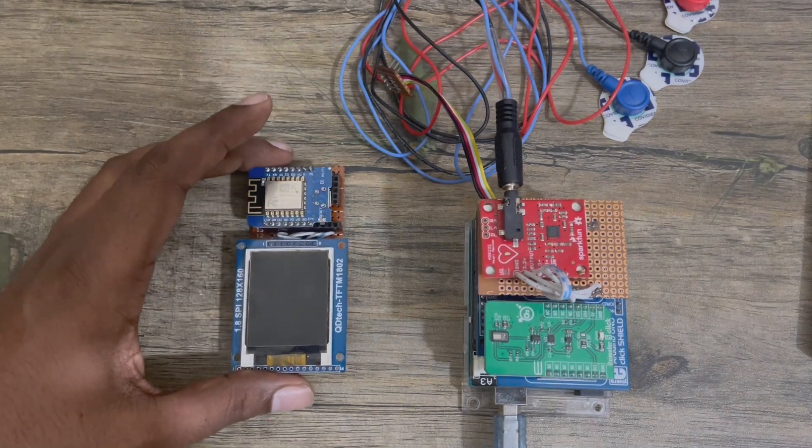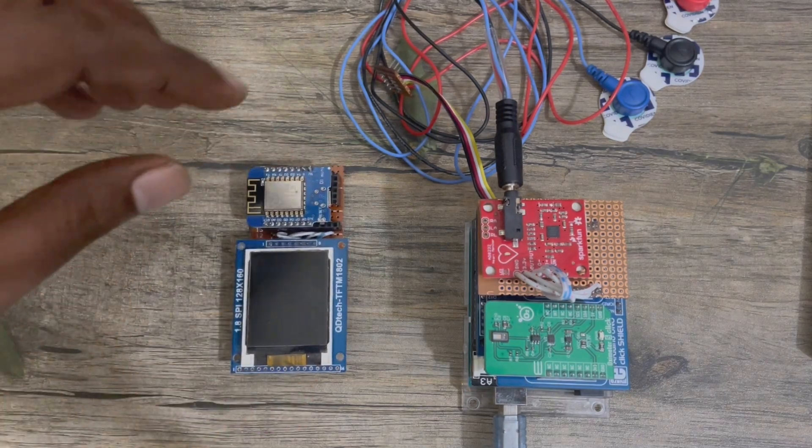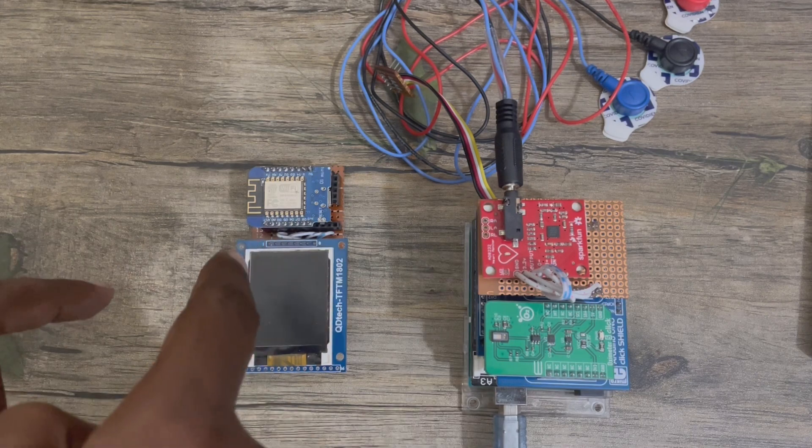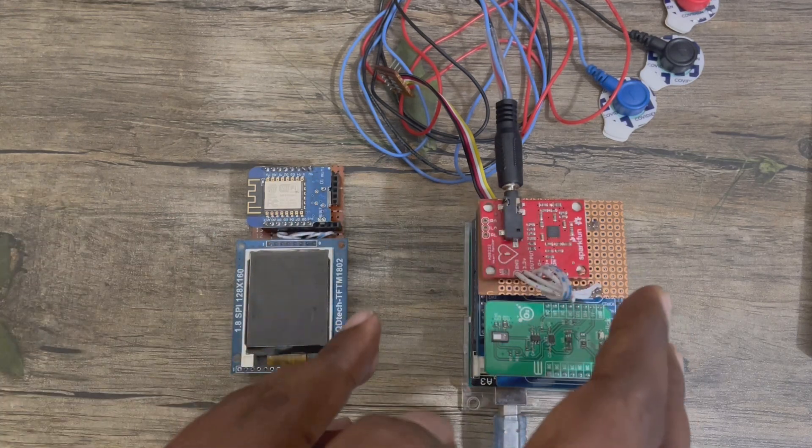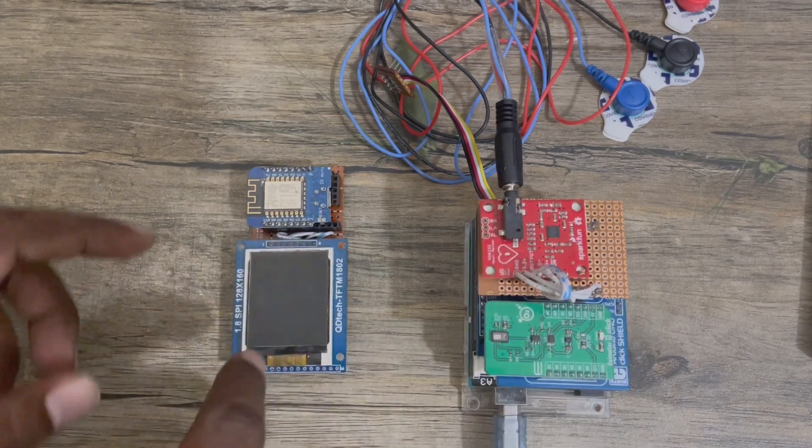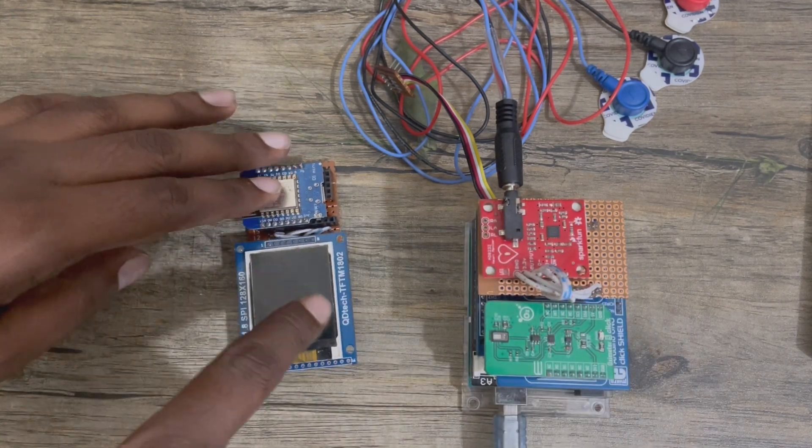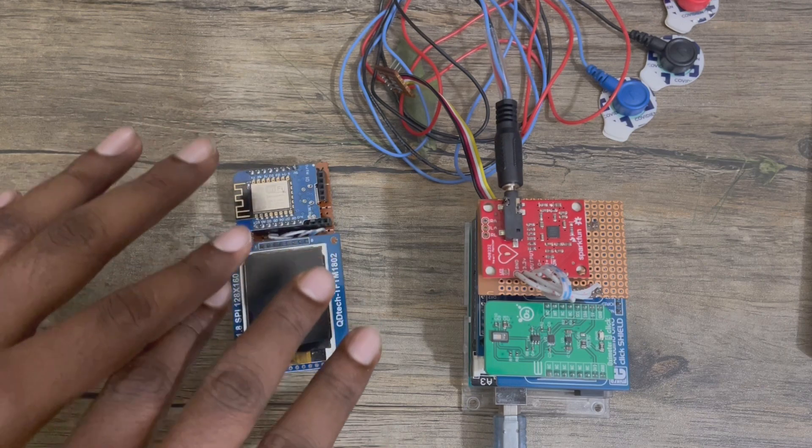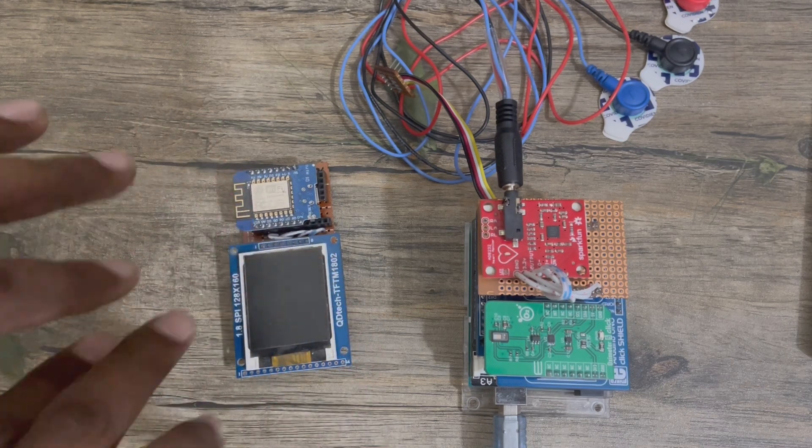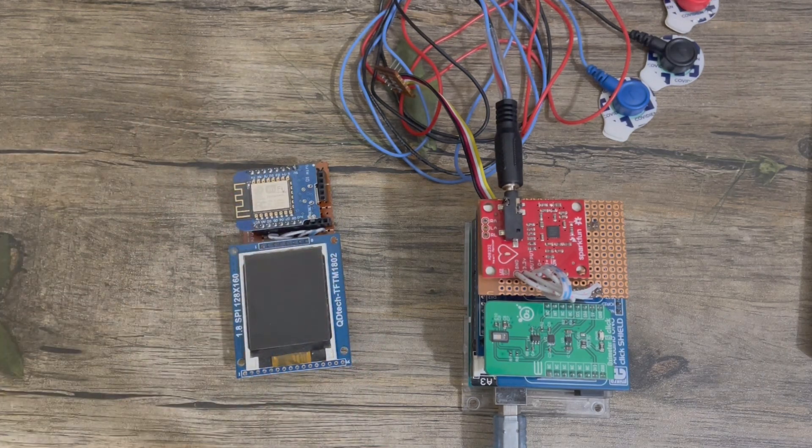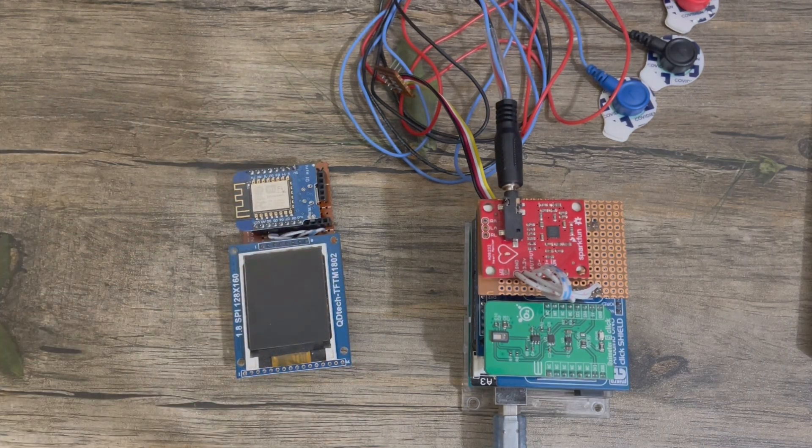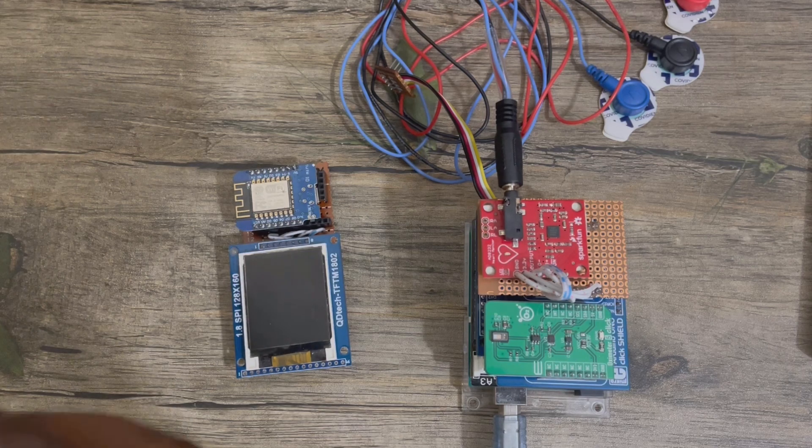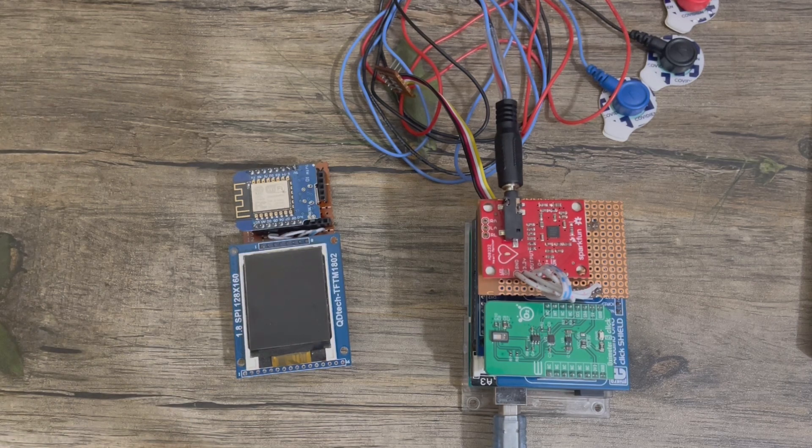And this unit receives those data from this unit and displays the data to this TFT. And at the same time, it also publishes the data to the cloud.